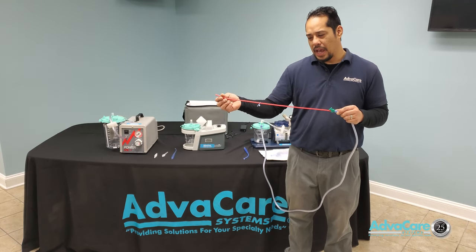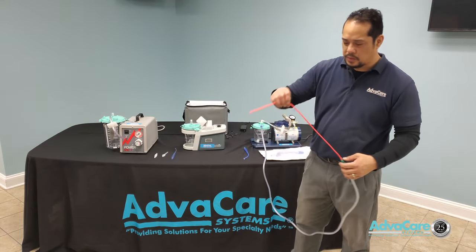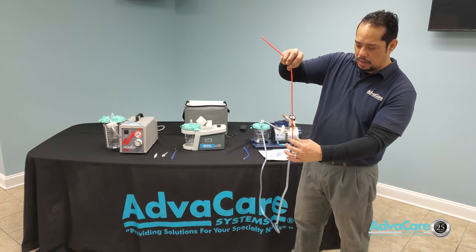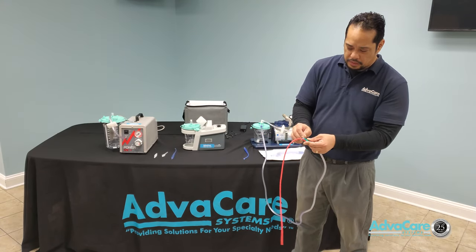The smaller the number, the thinner the tubing and the smaller the inner diameter. This part here is a plug that would allow you to plug at the base of the catheter to be able to open a vacuum circuit.